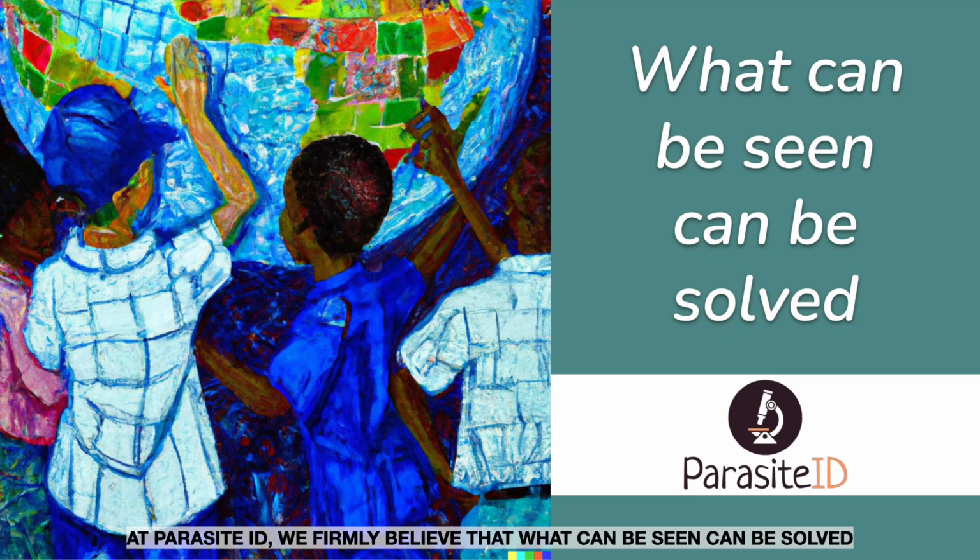At Parasite ID, we firmly believe that what can be seen can be solved.